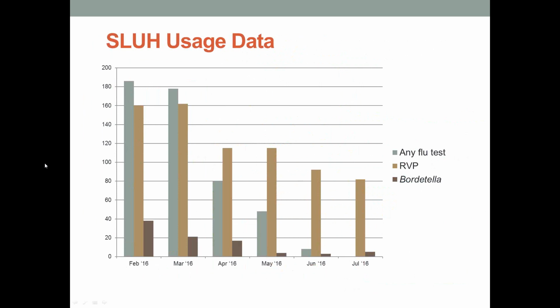So everybody's not getting a respiratory viral panel. The other thing that we saw when I looked into these patients individually is that they're kind of a split between our bone marrow transplant patients and ICU patients. So these are really sick patients, which gave us confidence that the test isn't being overused or misused, that these are people in whom this test was necessary.